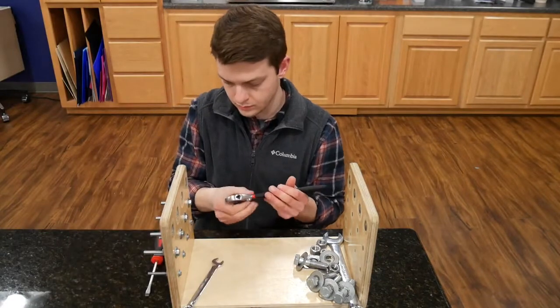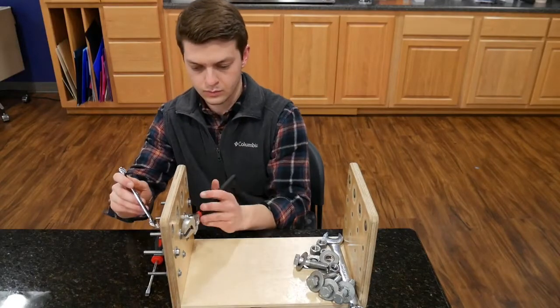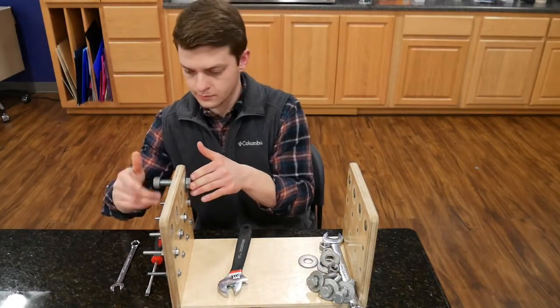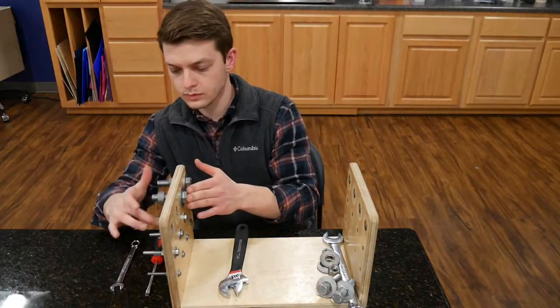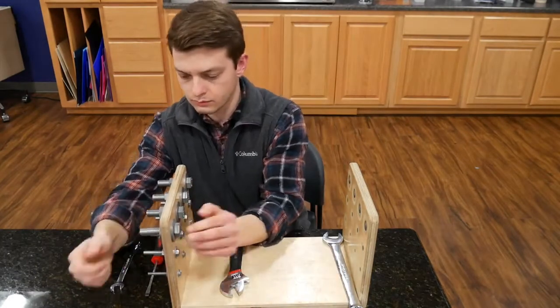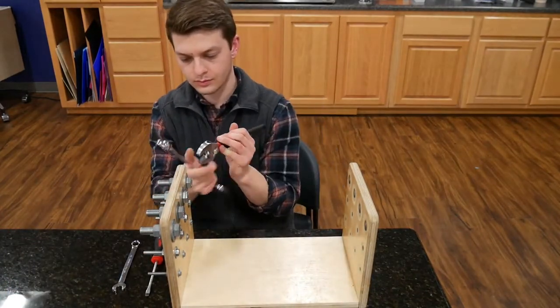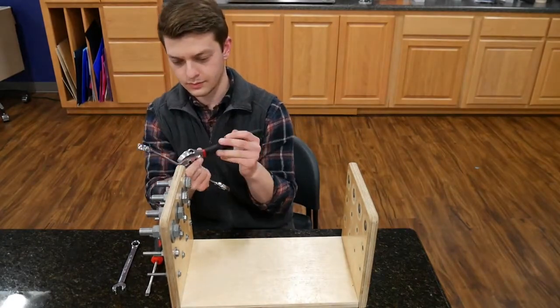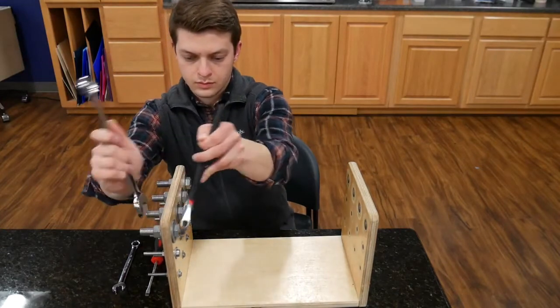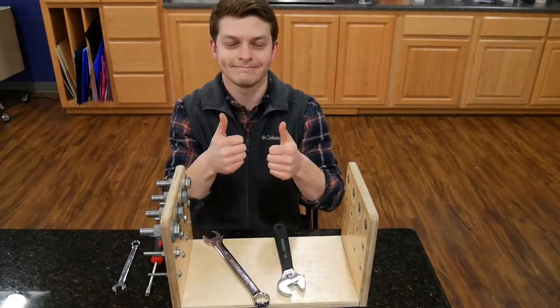I'm going to tighten all these. When we move to the top row, you may see me drop a nut during the assembly portion. Notice that I don't bend down to pick it up — I just keep going. Right there, I dropped it, didn't get it, and just kept going. As I approach the last combo and finish tool tightening the last nut and bolt, that is when the examiner would stop the stopwatch — as soon as the very last nut and bolt combo is tightened.